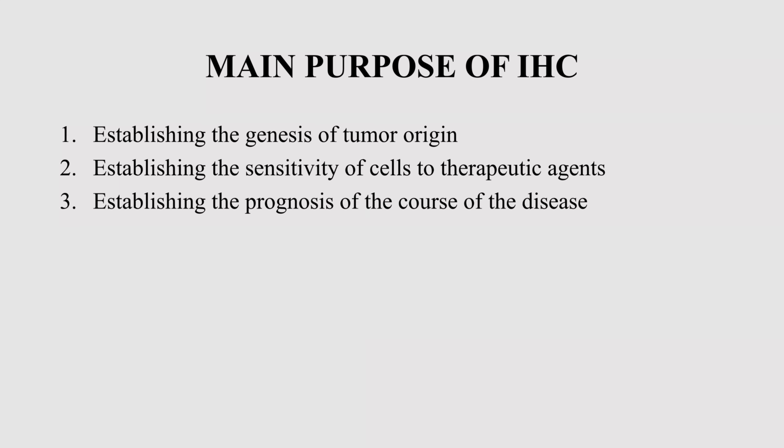If we find metastasis, immunohistochemistry helps us understand whether the tumor can react to some chemotherapy.